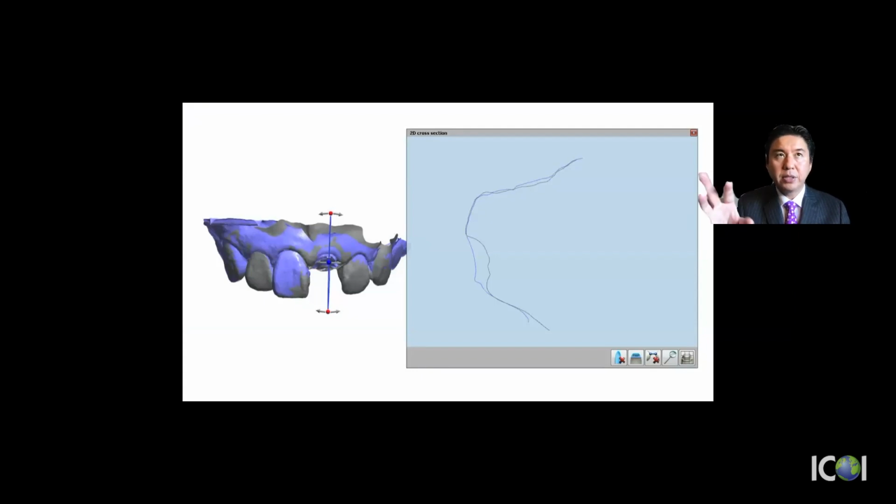Schropp said that after extraction, within 3 months, you're going to have 50% bone loss. But with implant placement 4 months after the extraction, with immediate bone graft and a soft tissue shell, you don't see any soft tissue collapse on the bone at all at 4 months. After this, you put the final abutment and the final crown, supporting healthy soft tissue on the bone, and you won't get any bone loss at all in the future.